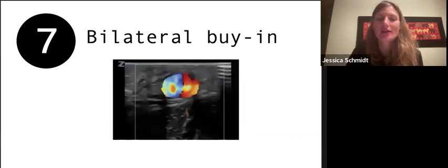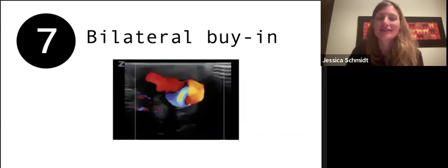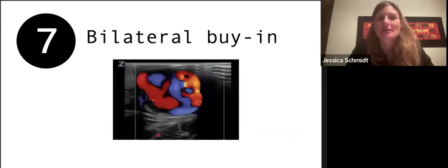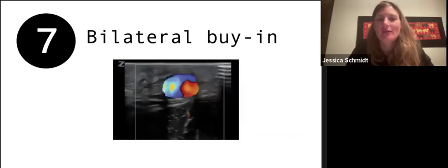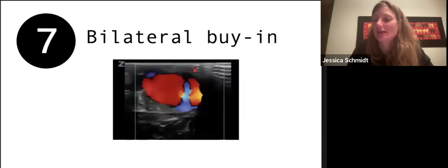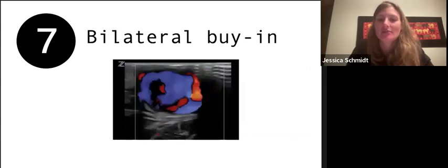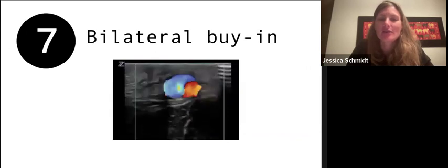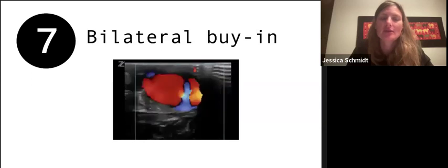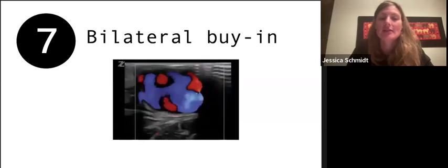A quick note on bilateral buy-in. So as I said, ultrasound is a team sport, a multiplayer game. All parties have to be willing to put in effort. And while ultrasound, I believe, is an extremely useful and really practice-changing tool, it may not be the right time, and both parties may not be committed. And so doing this needs assessment, talking about goals, and making sure you have all the right people there at the right time is important.